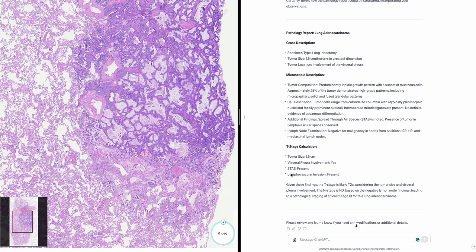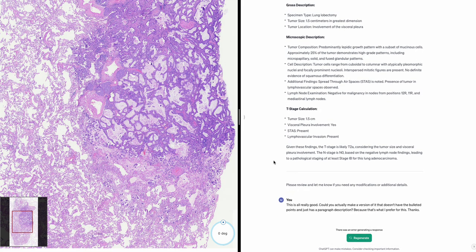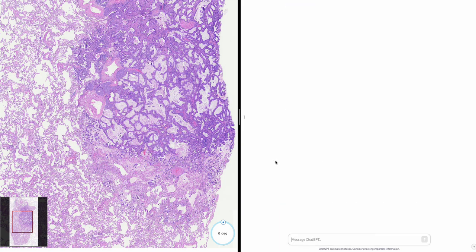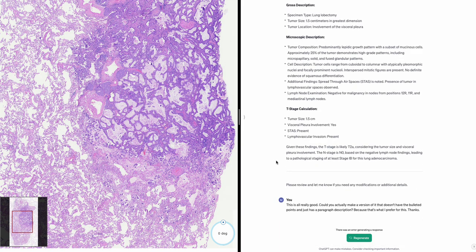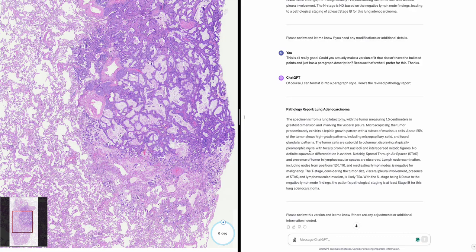Could you make a version without bulleted points, just as a paragraph description? That's what I prefer. Of course. Pathology report — lung adenocarcinoma. The specimen is from a lung lobectomy with the tumor measuring 1.5 centimeters in greatest dimension and involving the visceral pleura. About 25% of the tumor shows high-grade patterns including micropapillary.